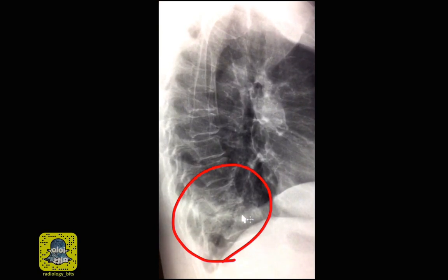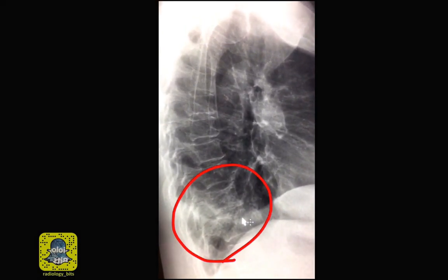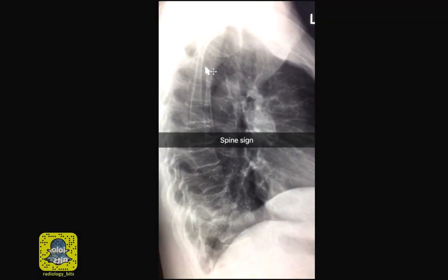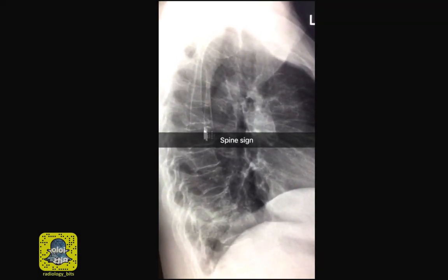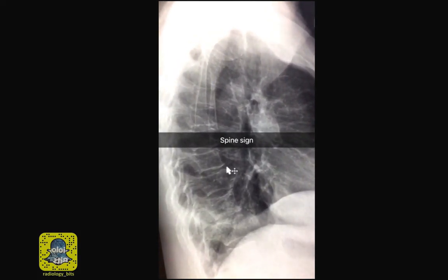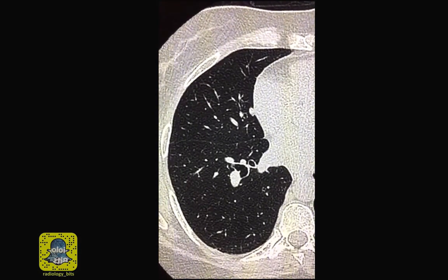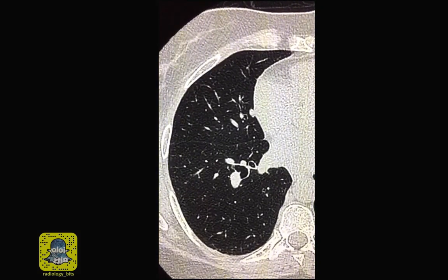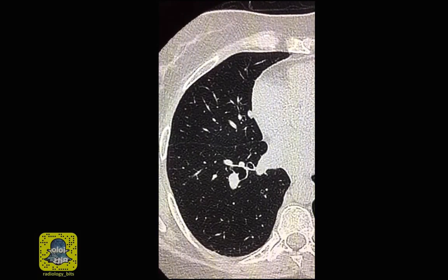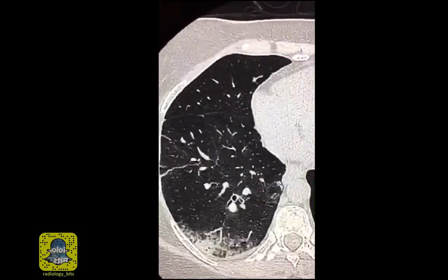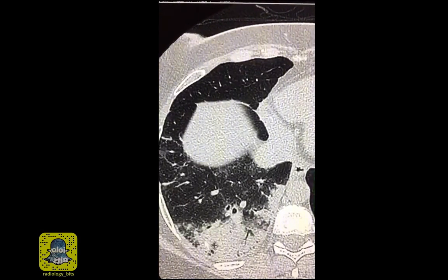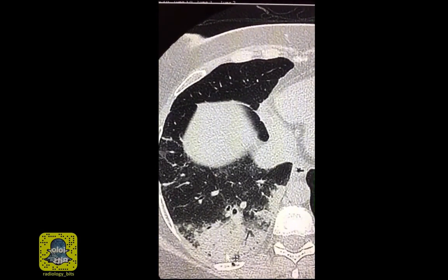Which is the case here — you see this sudden increase in density in the lower lung corresponding to what you thought was abnormal on the frontal radiograph. This is what we call the spine sign: when you see a sudden increase in density in the lower lungs denoting abnormality there. Since the finding was missed on the chest radiograph, unfortunately the patient underwent CT since she was symptomatic, and the CT confirmed the presence of right lower lobe consolidation consistent with pneumonia.